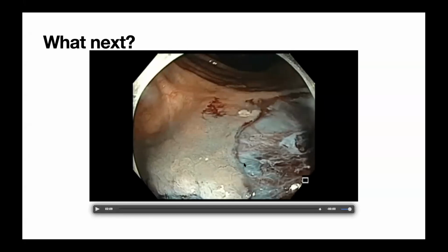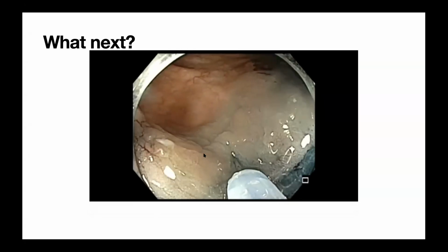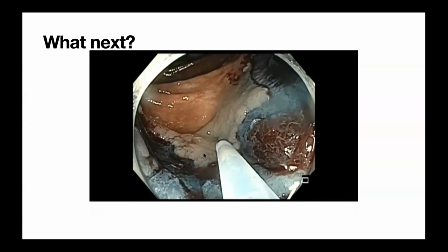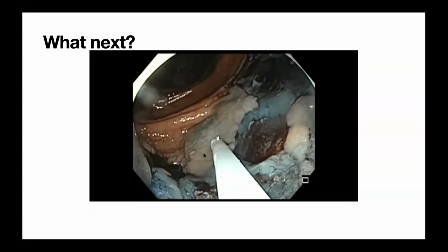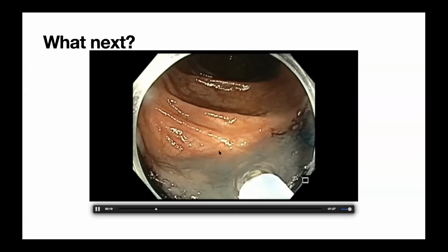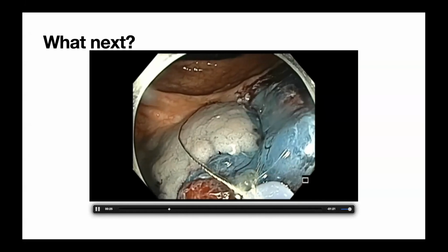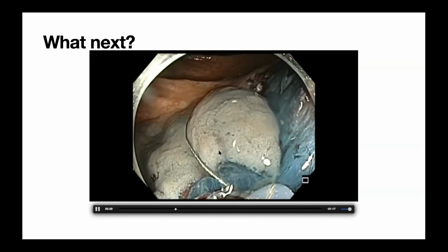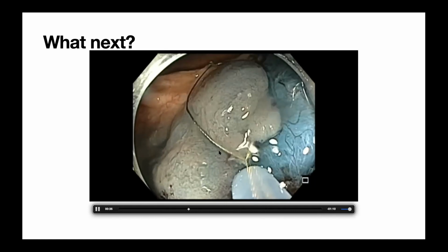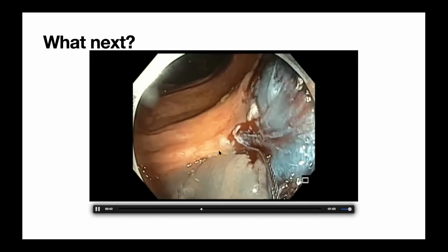For this kind of piecemeals of less than 10 millimeter pieces that you're taking, there are two other snares, just for the sake of completion of discussion, for people to know. One of them is a monofilament snare from US Endoscopy. Now I think it is taken over by Steris, and that is one good snare. And another one is a 10 millimeter cold snare from Boston Scientific. That is a little more stiffer. So both have that kind of ability to anchor and avoid that slippage that you were talking about when you're using the other snare. And just for people to know what other options are available. Yeah, thank you.